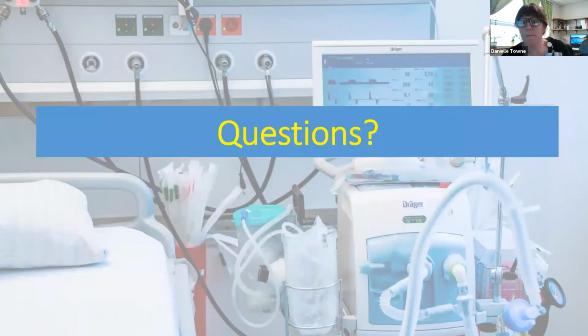So in closing, the best thing you can do for your patient on a vent is to be thoughtful about your strategy, frequently reassess to see if it's working. Don't assume that putting in normal vent settings will work on all patients. Normal vent settings work in normal patients, in normal lungs. Abnormal lungs are going to mean abnormal vent settings. And you just have to be thoughtful enough to work through the process to see how abnormal they are really going to be and whether it is benefiting the patient.